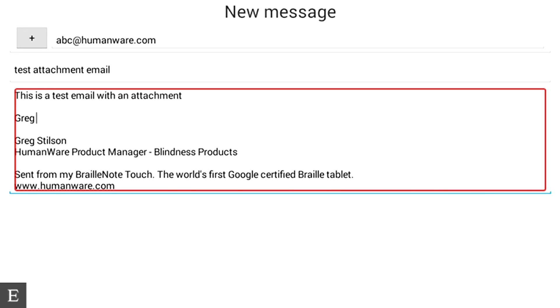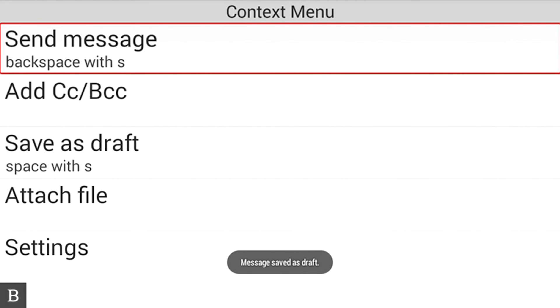You may be wondering how to actually attach a file. In a previous video, we created a document called Video Document. To attach that DOCX file created in Keyword, I can go into the contextual menu, which is available in every Keysoft application and even some third-party apps. It shows all the functions available in the application. I'm going to press Space+M to open the context menu. The first option shown is Send Message with the shortcut Backspace+S.